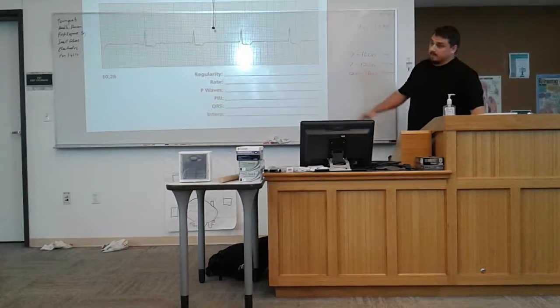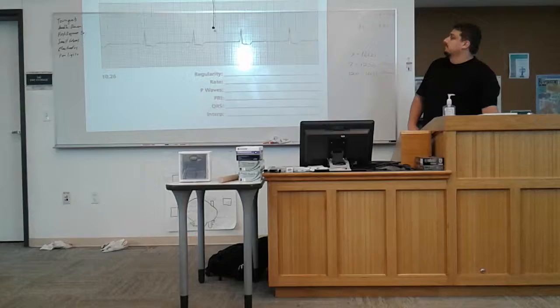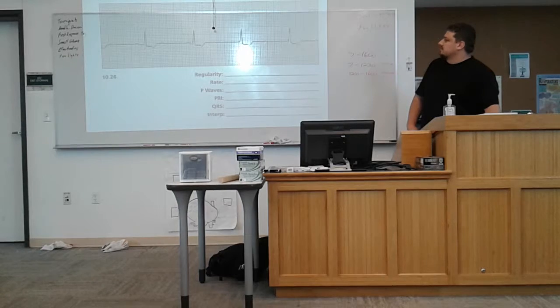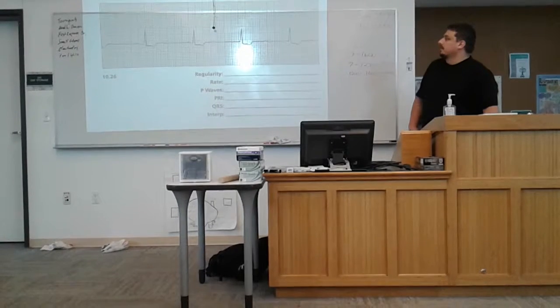Okay, so where did you stop? So we know it's a third degree, P waves march out, QRS march out, what else do we see? There she is. Come hither. I mean, it's junctional in nature. Okay, why is it junctional? Because it's narrow QRS and the rate would indicate that it'd be a normal rate for a junctional rhythm. And since it's going below the AV node and narrow, it can't originate in the ventricles, otherwise it'd be wide. Is that what you're saying, Noah? Yeah. Does everyone agree though that this is junctional in nature? Yes. Okay. Do we see anything else?